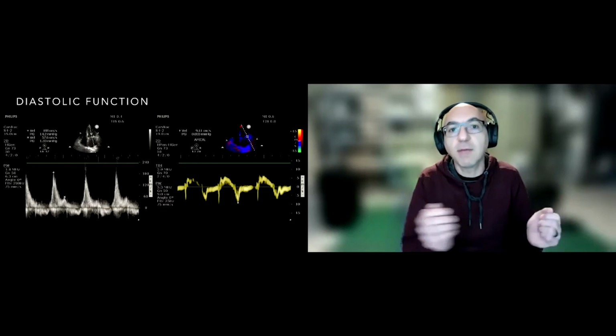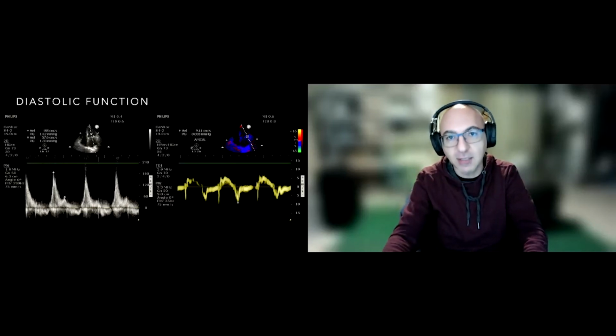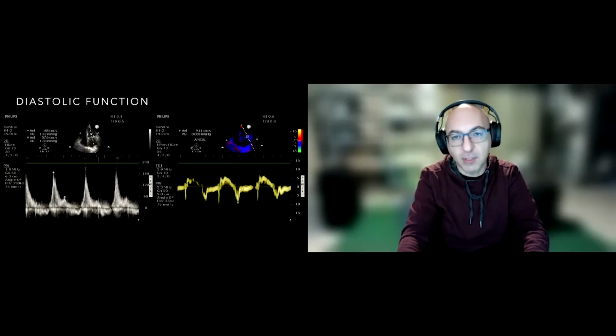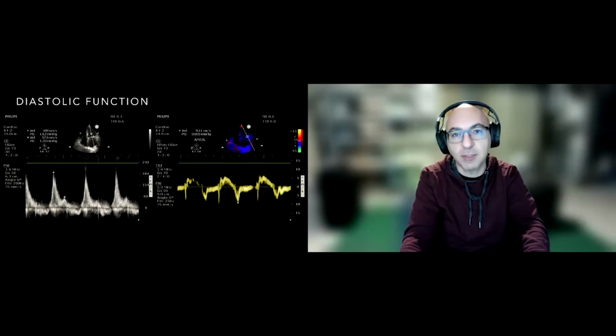Am I going to hit them with everything and end up with an intubated patient who's on dialysis, or am I going to be careful in just increasing the PEEP and not diuresing them, because they turn out not to have high pressure pulmonary edema, only low pressure pulmonary edema?